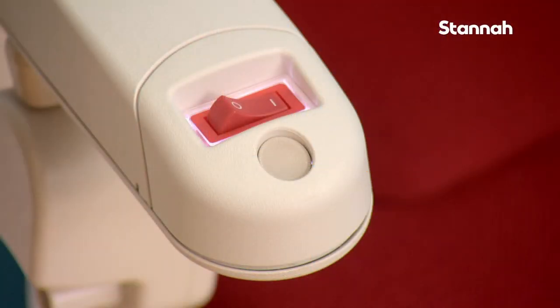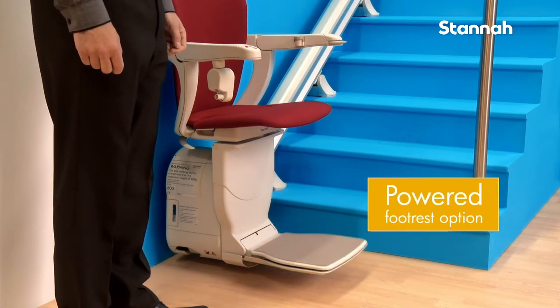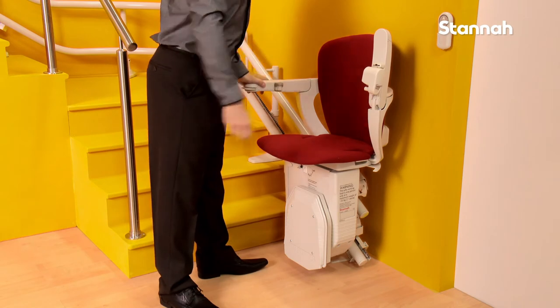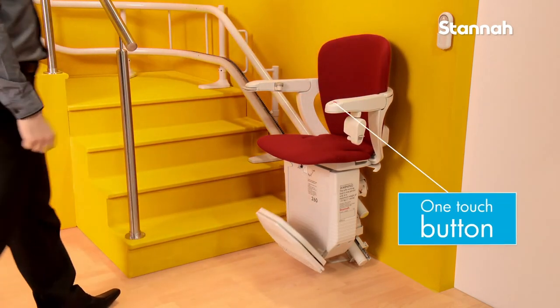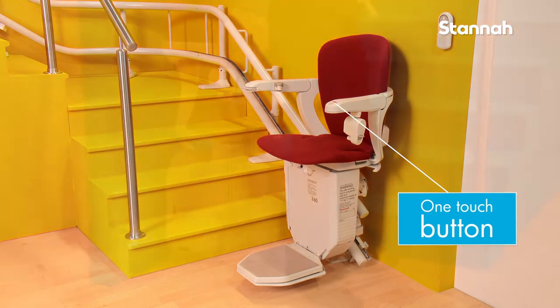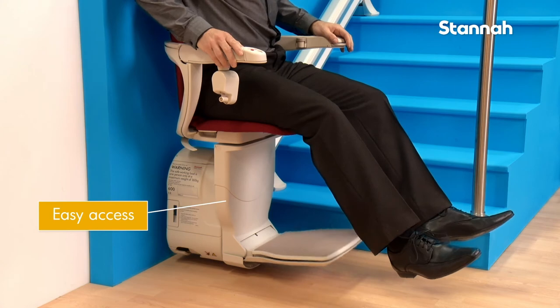Our powered footrest is an optional extra and is fitted at the end of the chair arm where you can easily reach it. Just one touch of the button is all it takes to fold or unfold the footrest independently of the seat and arms. Sometimes it's easier to get in and out of the stairlift with the footrest folded out of the way.